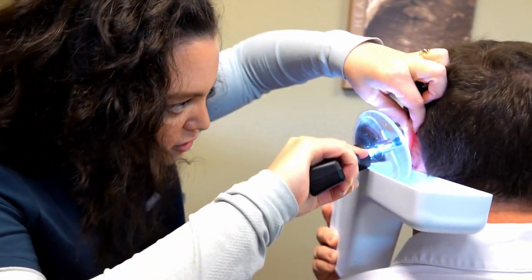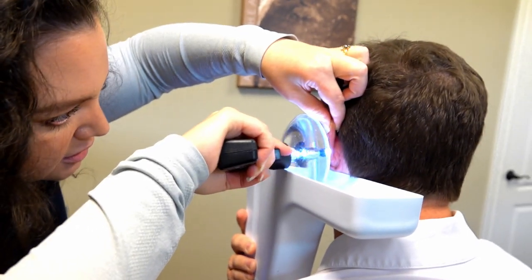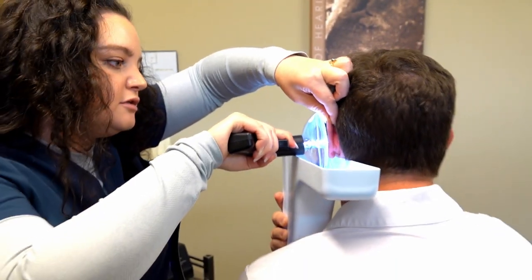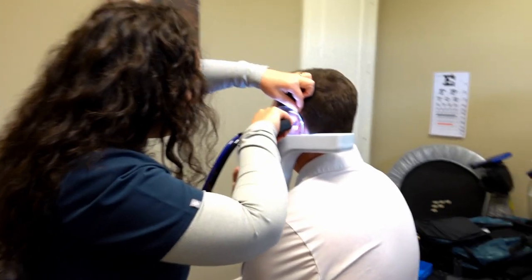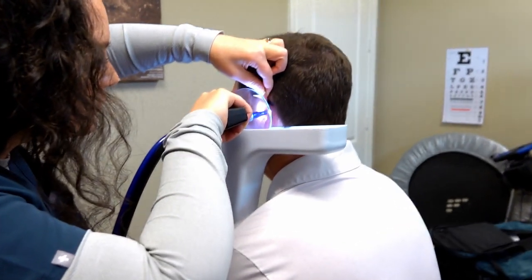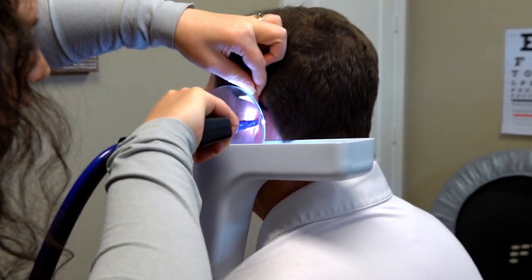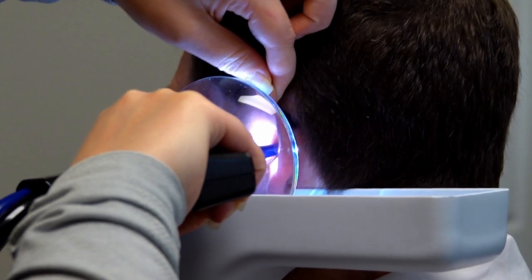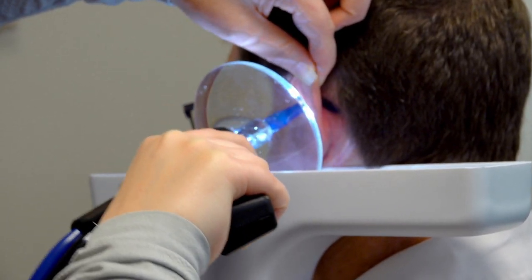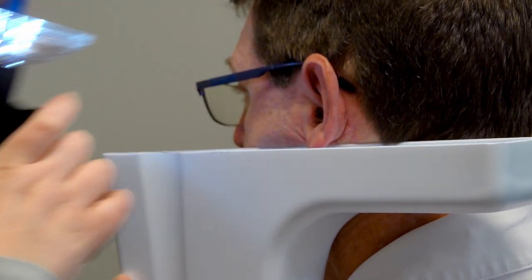We're just going to start with a gentle flush. One, two, three. Got some coming out already. Doing okay? One little stubborn piece here that I'm actually just going to take a little tool to.